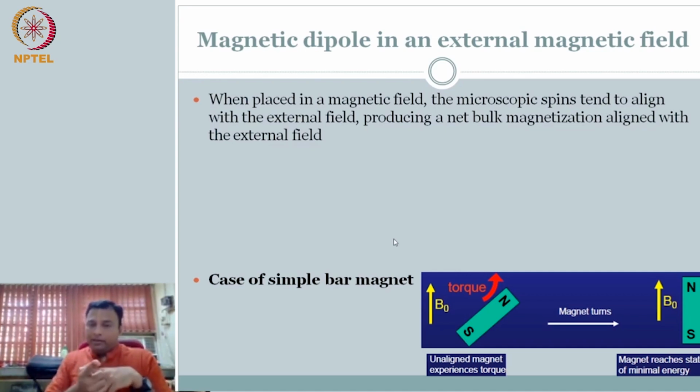In the case of the bar magnet, the bar magnet doesn't have any angular momentum. Whereas in the case of the spinning magnet, not only do you have a spinning nucleus and a magnetic moment vector, which is similar to the effect of a bar magnet, but it also has an angular momentum. So what happens when you have an angular momentum is, it is trying to align itself to the magnetic field, but it is spinning, which means it has an angular momentum. I think there is one important concept that you would have heard. In fact, we used the term loosely in the previous slide: gyromagnetic ratio.